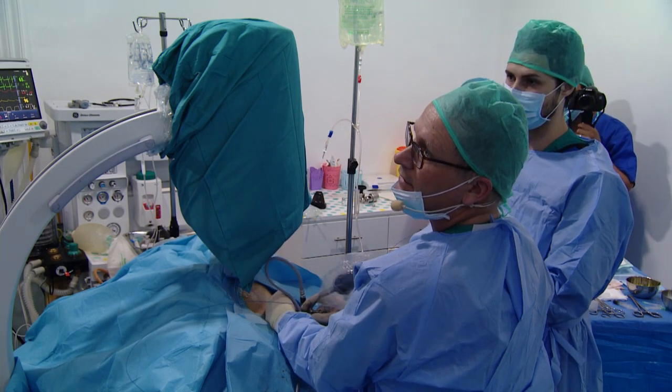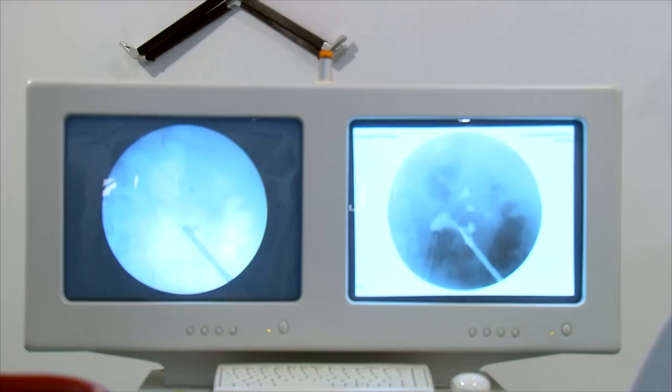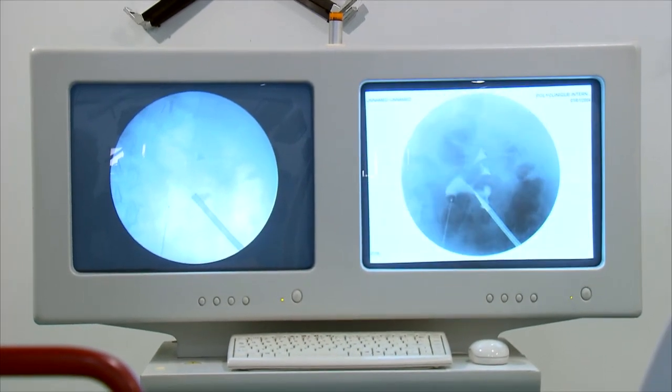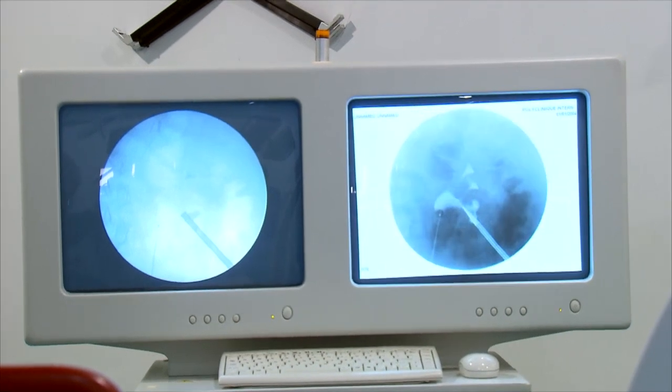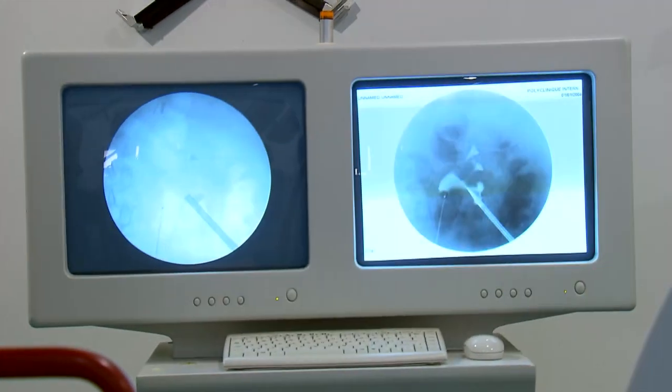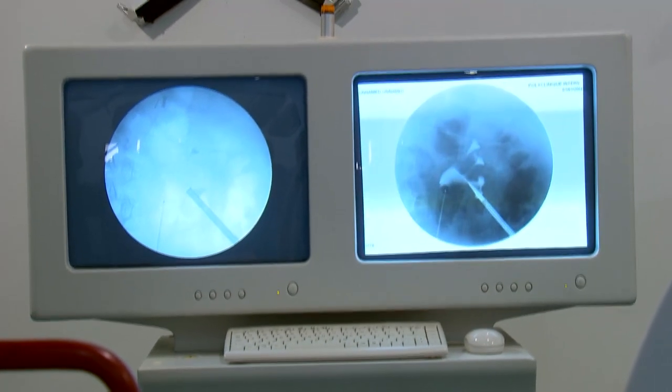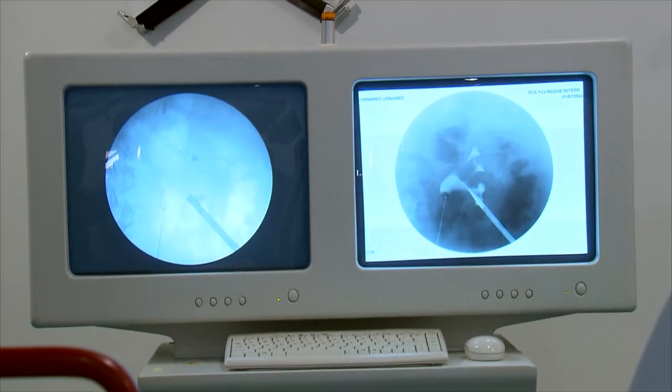Camera. Yes, thank you. We see that we have a stone in the upper calyx. Is it a stone in the upper calyx or the contrast media? No, no, no. I think it's a stone.